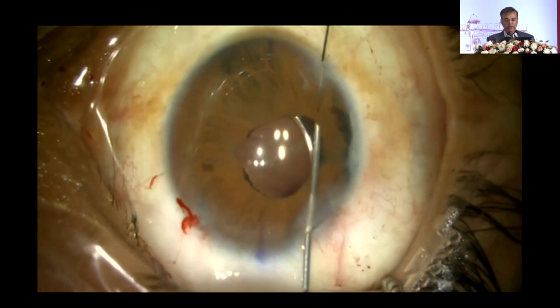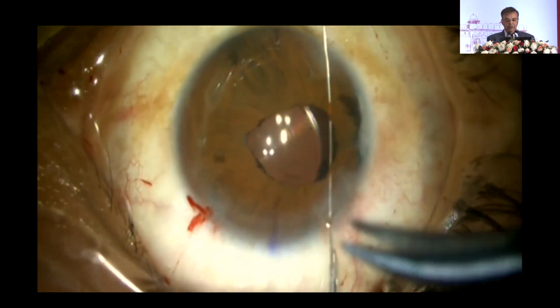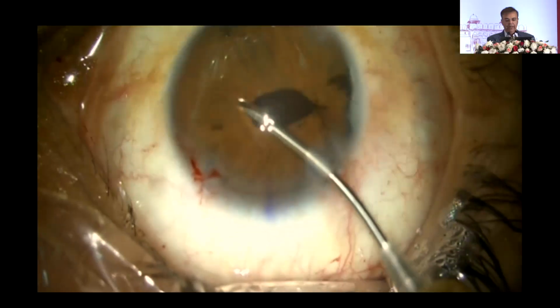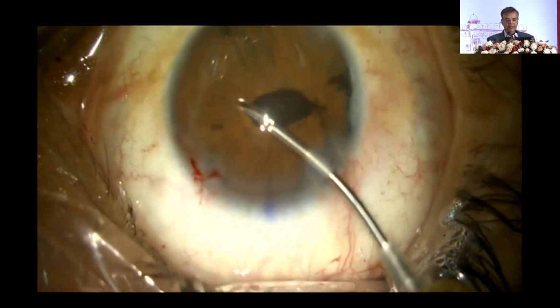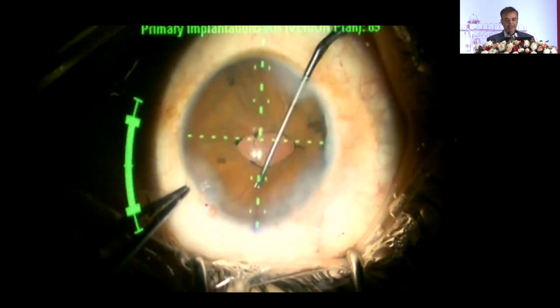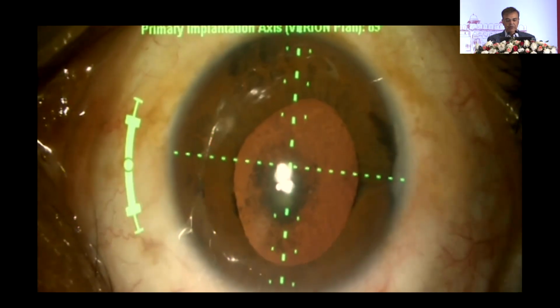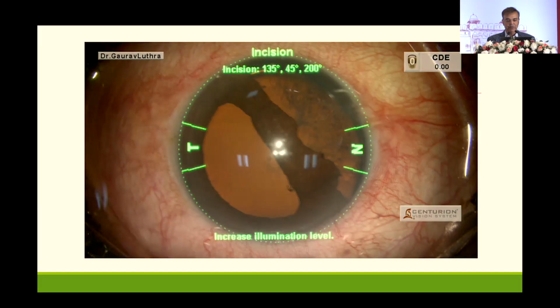And then we are doing a single pass 4-throw pupilloplasty here to bridge that gap and make the pupil smaller. So this works amazingly well. It's very quick. Once that is done, we have a slightly better pupil and more towards the central area. Then we do another small sphincterotomy to the other side. And eventually we are able to create a pupil which is now fairly well centered. Now on post-op, the patient looks well. You can see that the pupil is now fairly over the central area, and you can see the trifocal lens rings which are fairly well centered. Patient had a great outcome and did well.